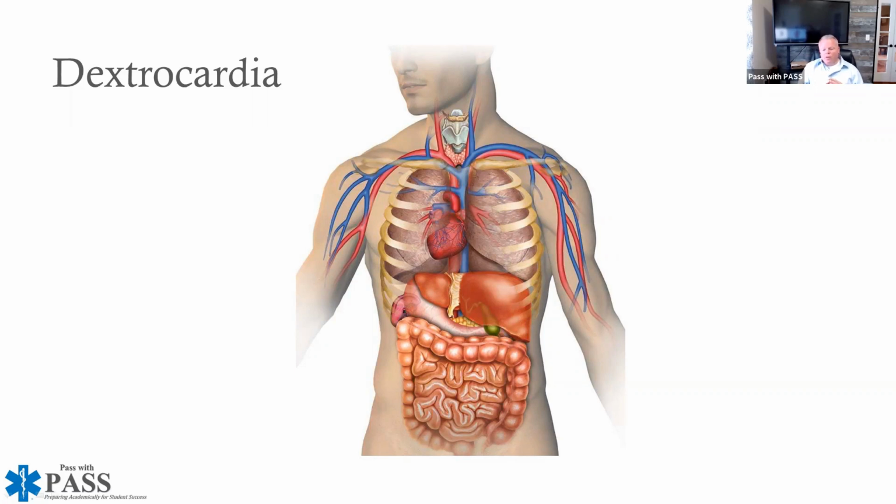Okay, so if we know and remember Einthoven's Triangle, just simply, I'm going from a negative over to a positive. It should give me a positive deflection on my EKG. Well, if now things are reversed, I'm actually going towards a negative lead, okay?